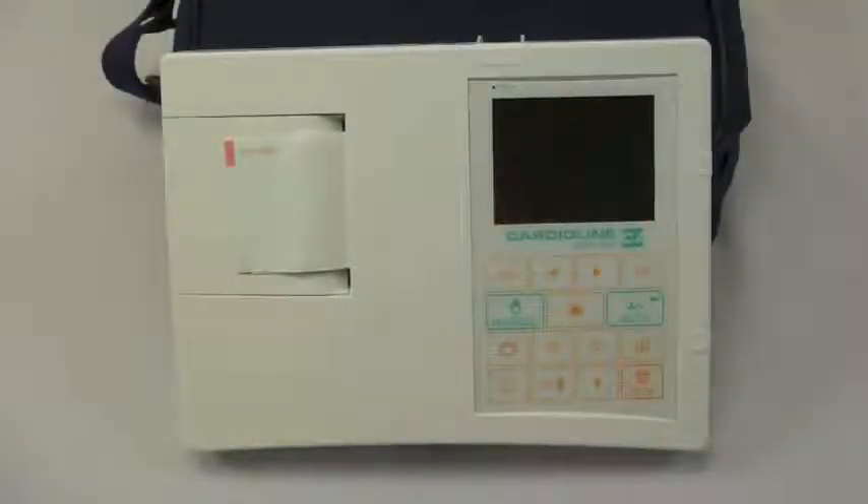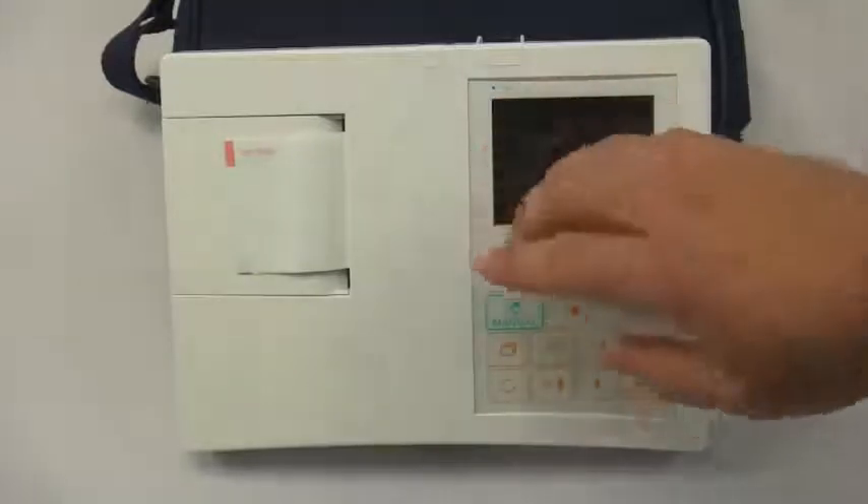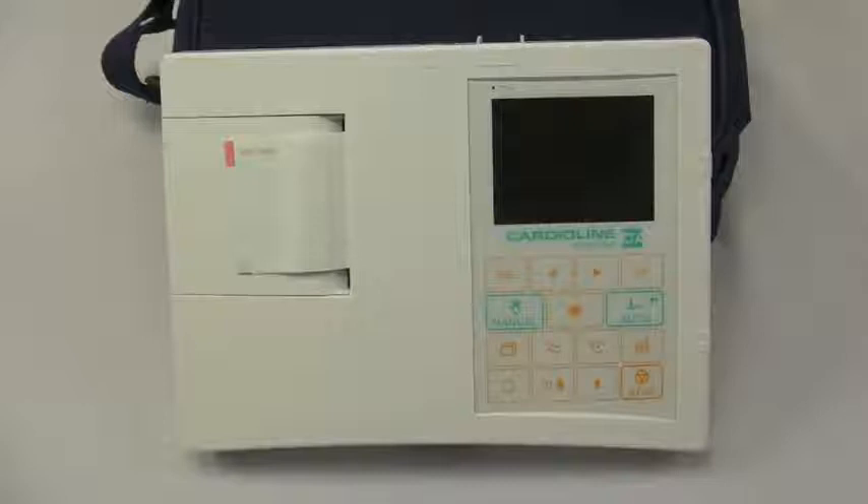CardioLine US is proud to introduce the newly redesigned CardioLine AR600 series. This 12-channel EKG is available in three configurations. The first is the AR600 ADV, which does not have a preview screen like this particular unit does. It would just have a small strip screen that would allow you to set the machine up for usage.